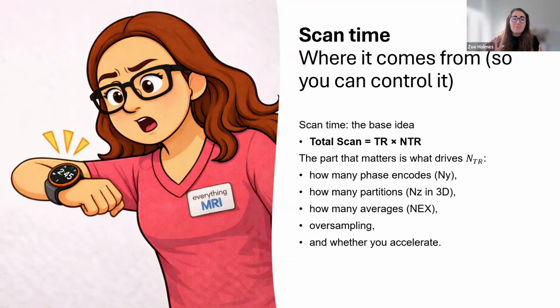But time is not only a resource, it is a quality factor, because motion artifacts will arise when your time blows out. Sometimes the best quality improvement is actually to shorten the scan and reduce your movement, even at the cost of the SNR, like we were saying before. If your patient isn't going to hold still, you're better off to have a reduced SNR image and still have a diagnostic sequence, versus one that is completely degraded because the timing was too long, because we're trying to maintain high SNR but we've introduced a lot of movement from our patient.